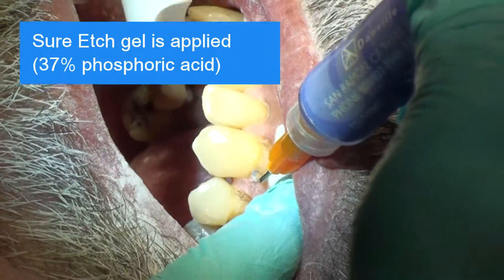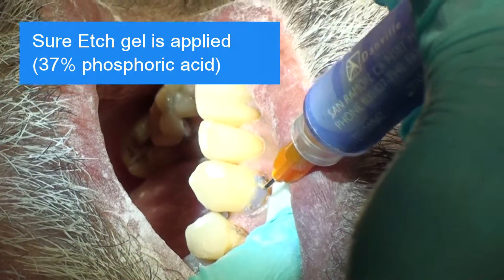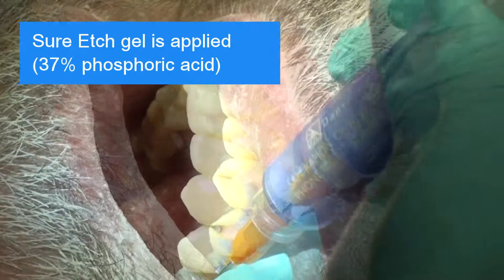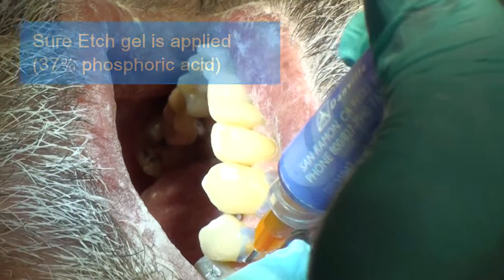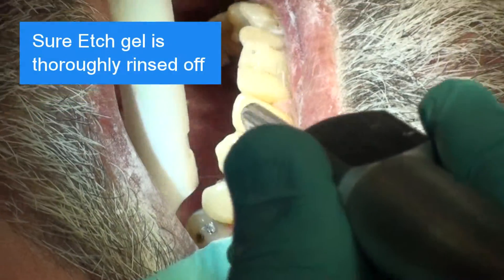Sure Etch Gel, a 37% Phosphoric Acid, is applied. The gel is thoroughly rinsed off.